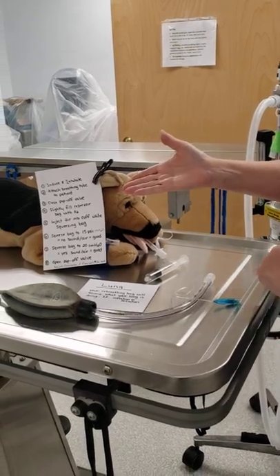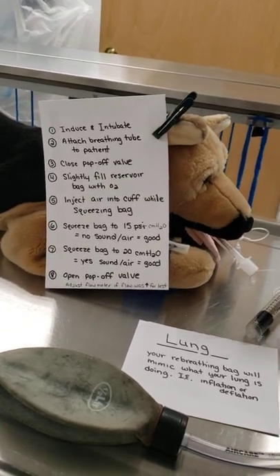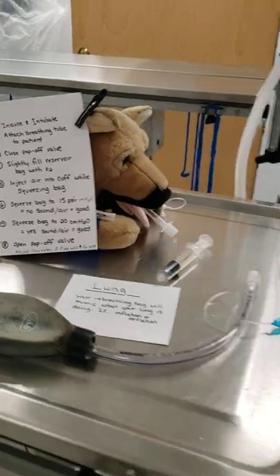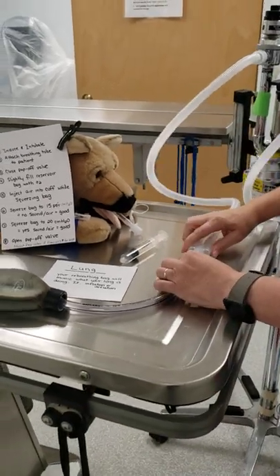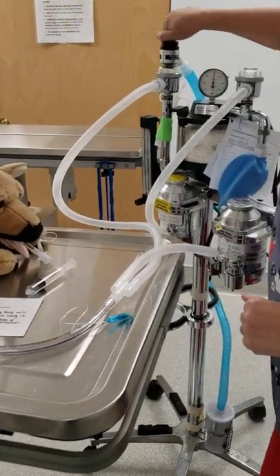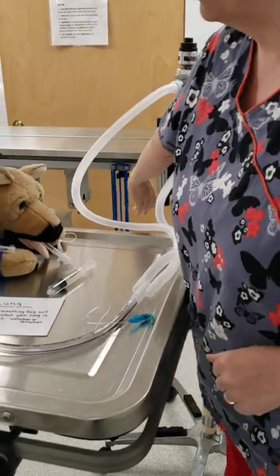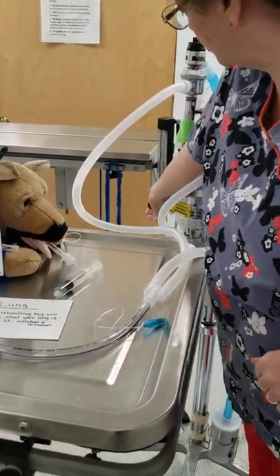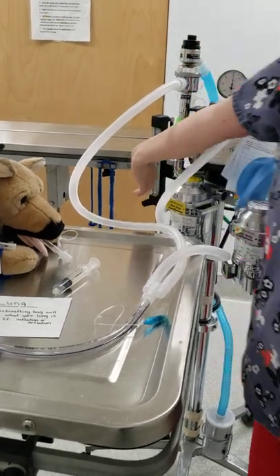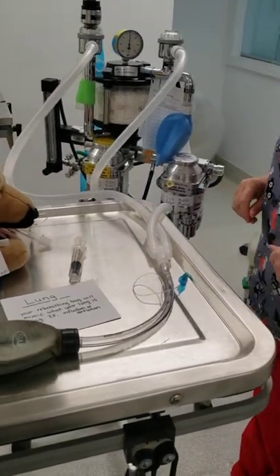I've written out instructions for you so that it follows the step-by-step of what to do. Step one: induce and intubate patient. Step two: attach breathing tube to patient. Step three: close pop-off valve. Step four: turn on your oxygen and slightly fill the reservoir bag with oxygen. You're going to most likely turn it on somewhere between 1½ to 2 liters per minute, which is what most patients will be calculated out as.